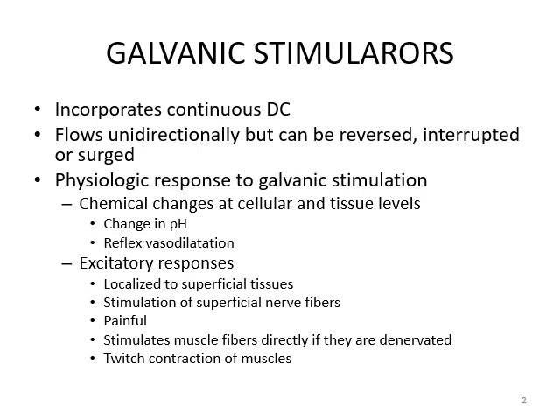The current may also stimulate the neuromuscular tissue and may result into excitatory response. The response is localized to superficial tissues only, and the superficial subcutaneous nerve fibers may undergo stimulation. If the stimulation is mild, the person who is getting the current may feel mild tickling or prickling type of sensations. If the intensity is strong enough, the person may have painful or burning like sensations.